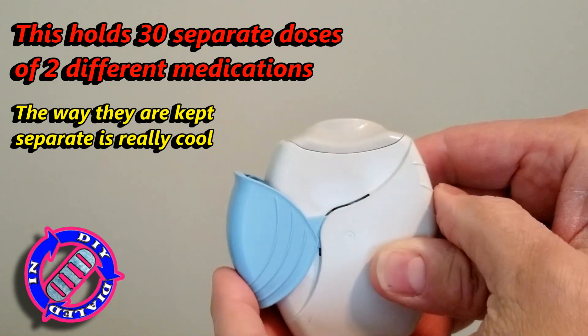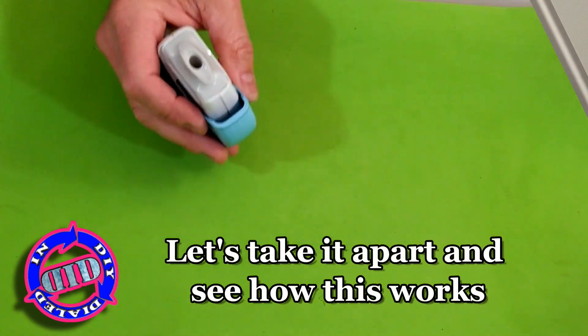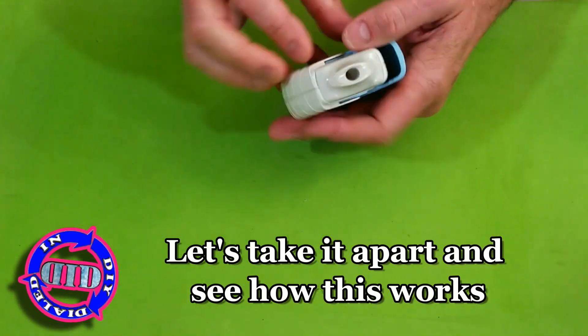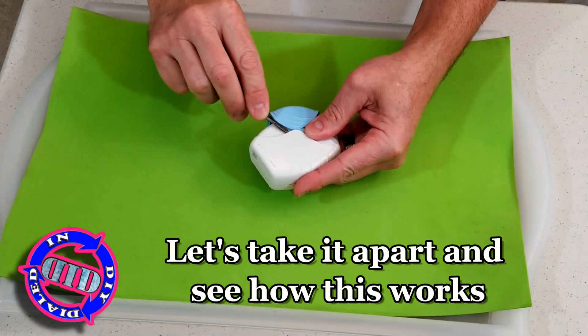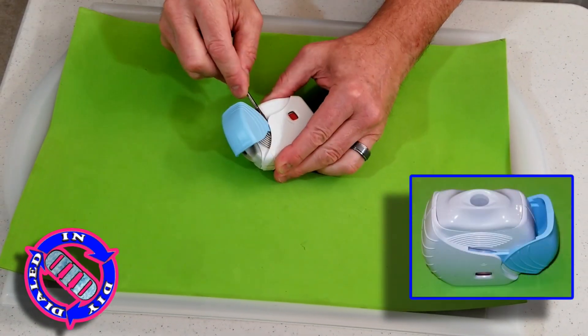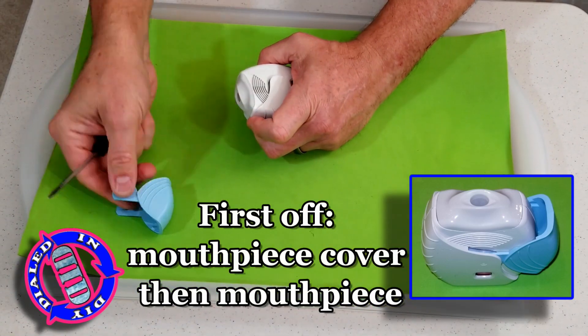If you're like me and you really like to know how things work, sometimes the easiest way to figure them out is to rip them apart. And that's exactly what we're gonna do piece by piece. Can you guess how many pieces we might end up with by the time I'm done? Take a guess — I'll let you know at the end.